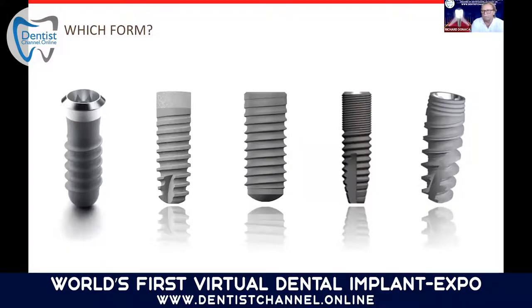Forms, you can see, of course, many, many forms in implantology today. Forms are supplying different threads, different designs of the implant, matching the teeth or not matching the teeth. They're all basically screws. Everyone has some kind of marketing ability to make their implant with the design of the thread more compatible to the natural tooth area than others. I think it's a little bit more marketing than it is study or scientific basis.